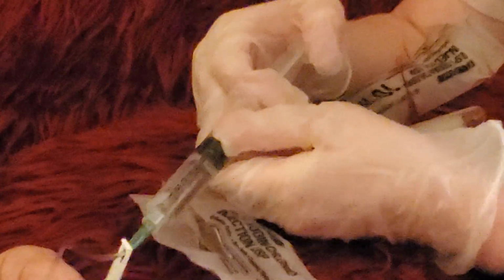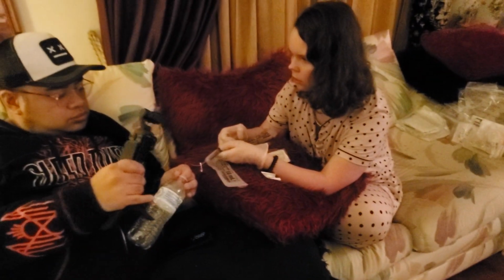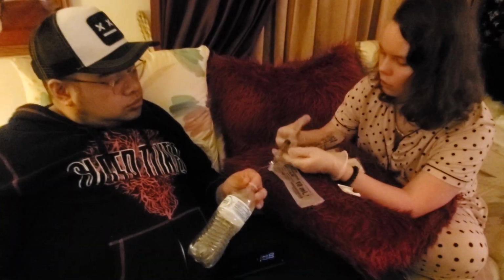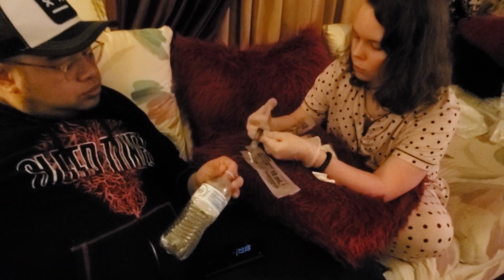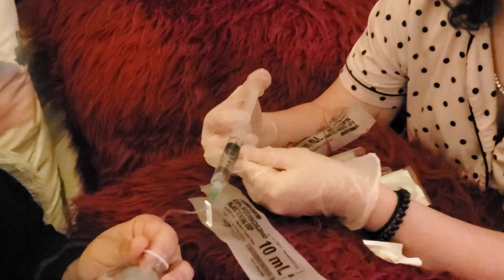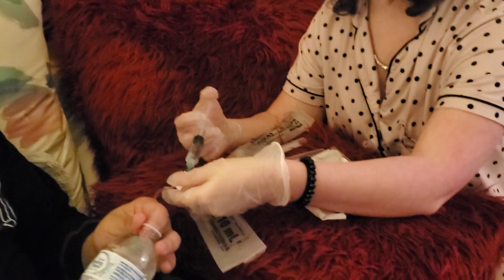It's patent. Now I want to aspirate to check that it's in the right place. I am positive for blood return. So now I'm going to start flushing, 10 mLs in total over 2 to 3 minutes. Pretend I did that. I don't want to waste all the water.